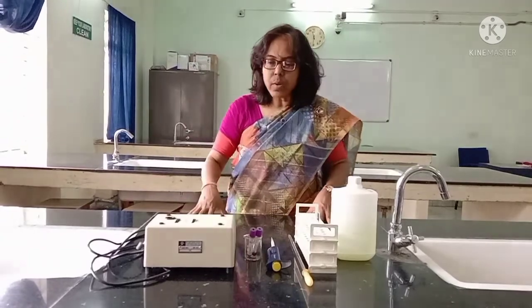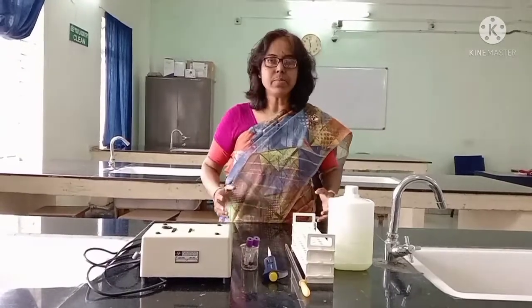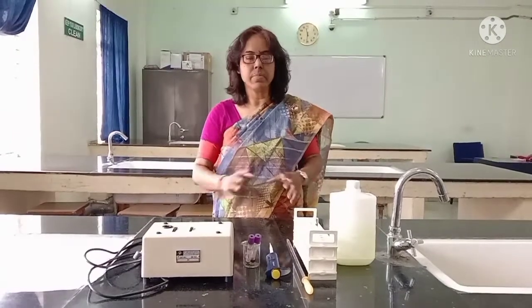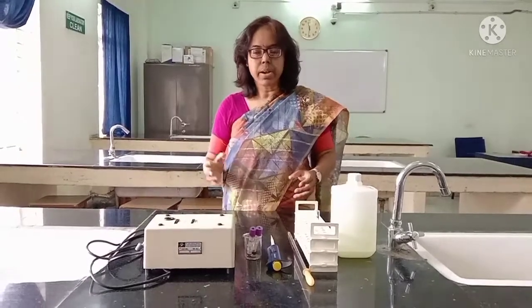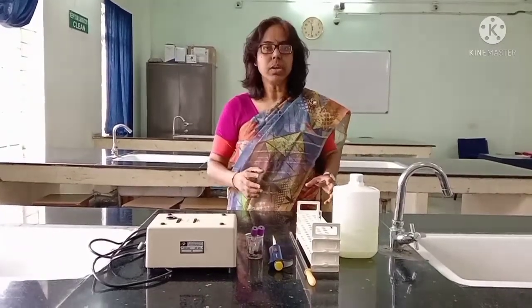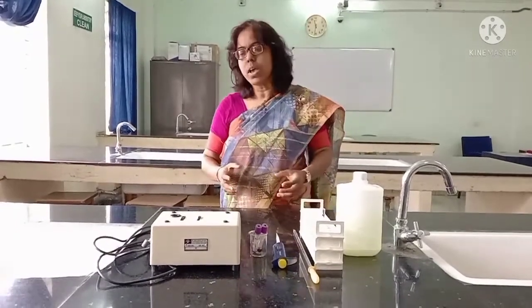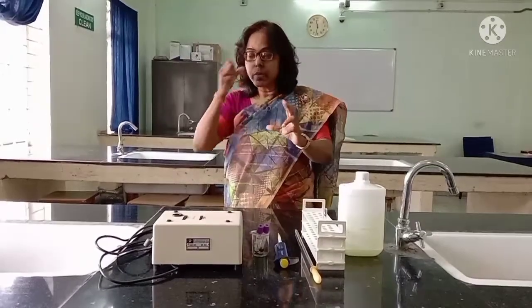Today you are going to see how hemoglobin concentration can be estimated by the cyanmethemoglobin method. Previously, I discussed the procedure and materials used for hemoglobin estimation by the Sahli's method. But this method is different because the Sahli's method was totally manual with some degree of manual error. The error percentage is much less in this case because we are going to get the actual value by using the colorimeter.